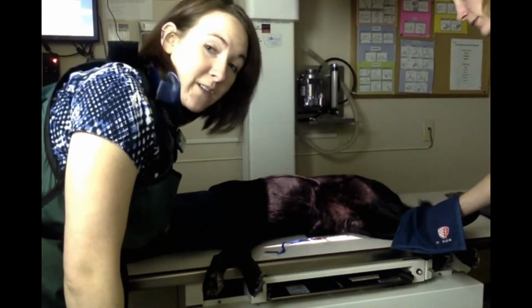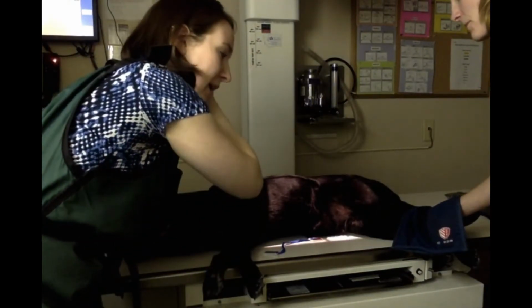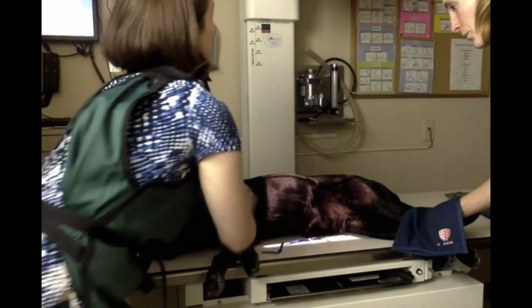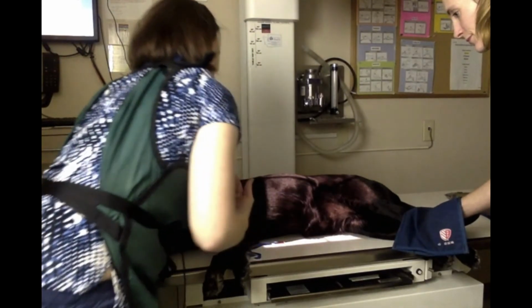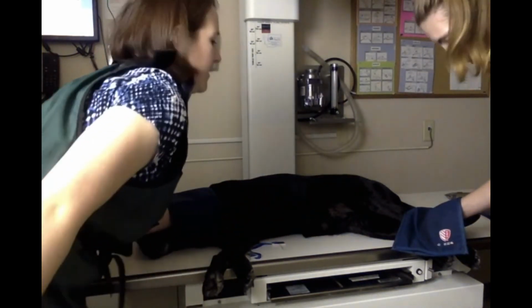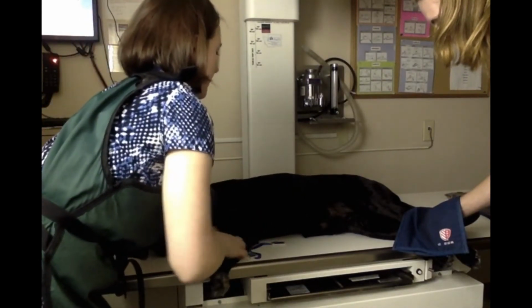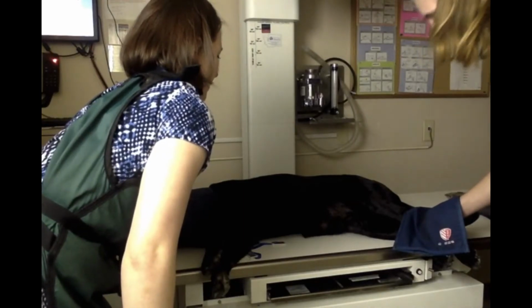All right, so this is our final x-ray for our barium study. This is about an hour after the last one. She's still in her right lateral view. We're going to take the image still at 110 kVp and 2.5 MAs. The marker is on the ventral aspect of the patient, and I have all of my information set in. So now we're going to go ahead and depress, wait for the machine to heat up, stay, Skittles, and then we'll press it when she's exhaling. Perfect. Good girl, Skittles.